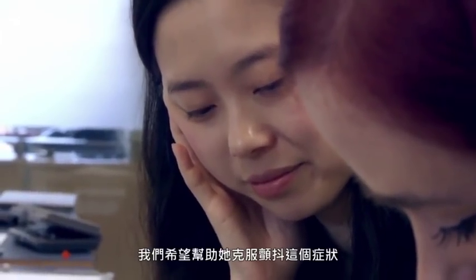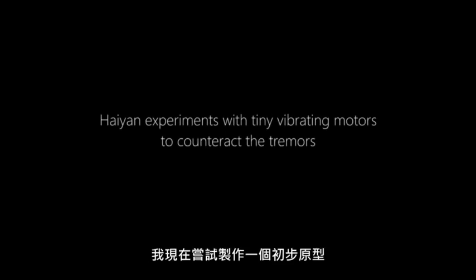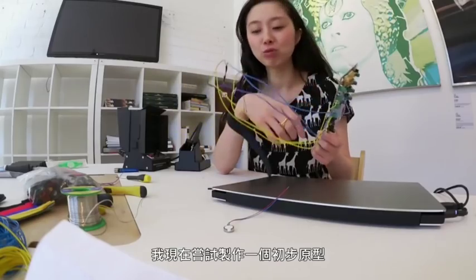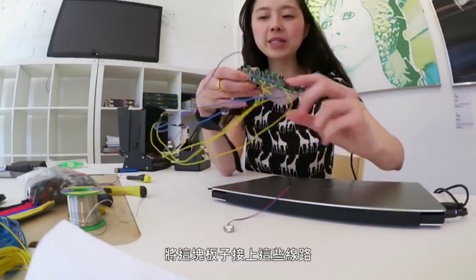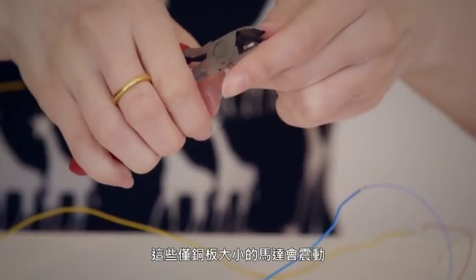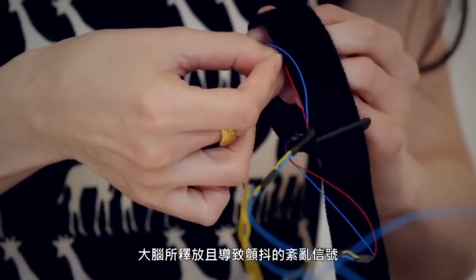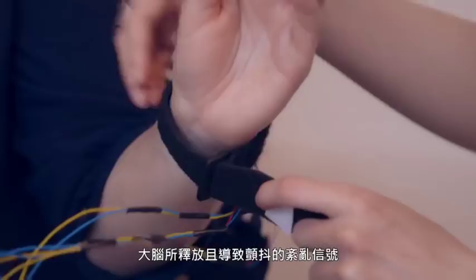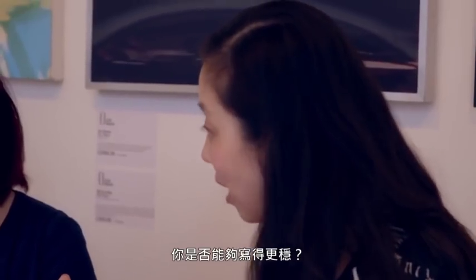How do we even begin to help her overcome this particular symptom of her tremors and help her regain her writing ability, her drawing ability? So what I'm doing is I'm making a very rough prototype. This board connects through wires to these tiny coin cell motors, and these motors will vibrate. I personally think this is short circuiting whatever feedback loop there is between the brain and the hand that's causing the tremors. So the idea is: if you are distracted by the vibration, are you able to write better?